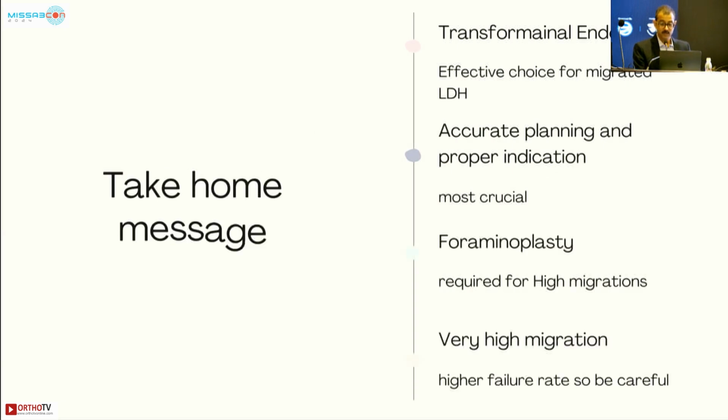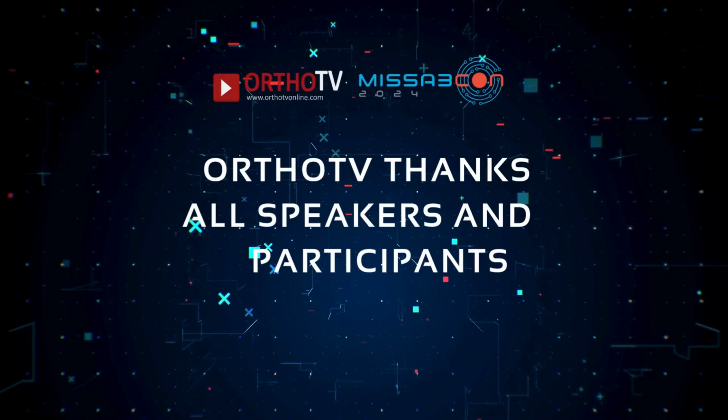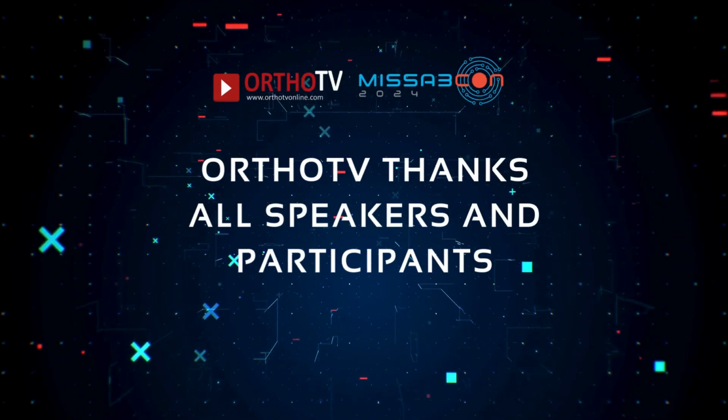So to conclude, transforaminal endoscopy is a good, effective choice for migrated herniations. However, the important thing is accurate planning and proper indication, which is most crucial. And foraminoplasty, or what we call foraminotomy, widening of the foramen, is required for high migrated herniations. And one should not try the very high migrated herniations in the early career of his learning curve. Thank you.